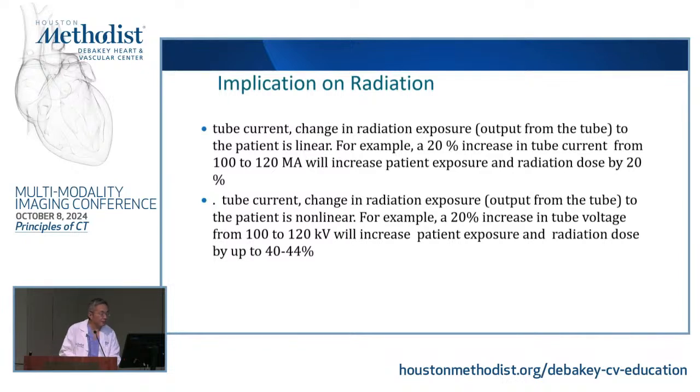And that's something that you need to keep in mind. Sometimes if you want to do a trade-off, you could keep the same kV and just increase the mA, for instance.